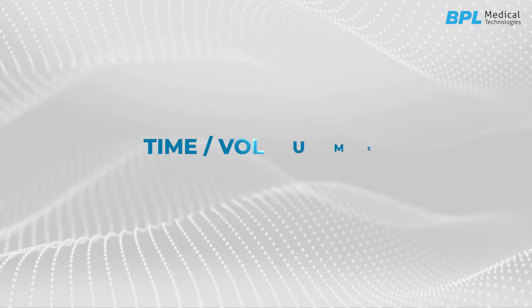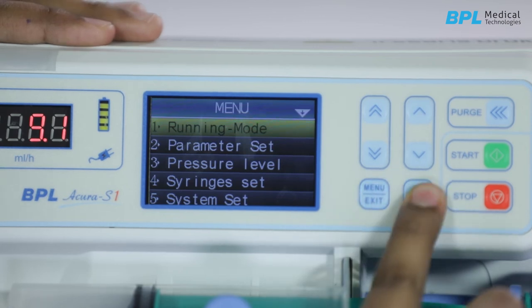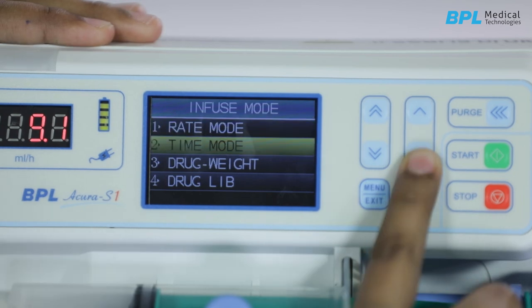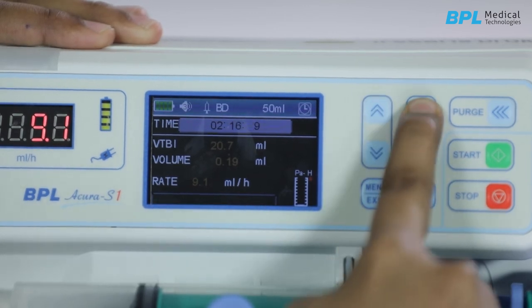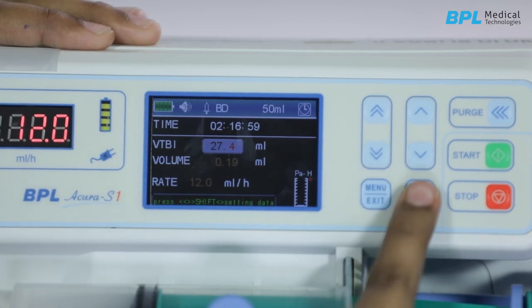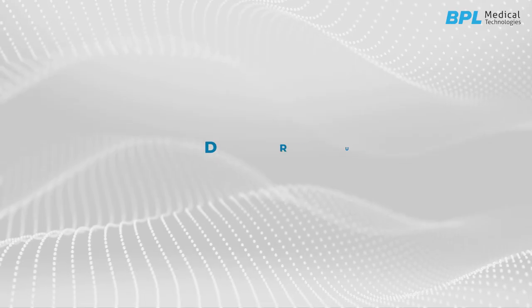For time or volume mode, press menu and the system will enter the main menu. Navigate to running mode and press OK to enter into running mode selection. Select time mode and confirm — the screen will show the time mode interface. Use these keys to set the desired infusion time, input the volume to be infused, and after these parameters are confirmed, press start to begin injection.